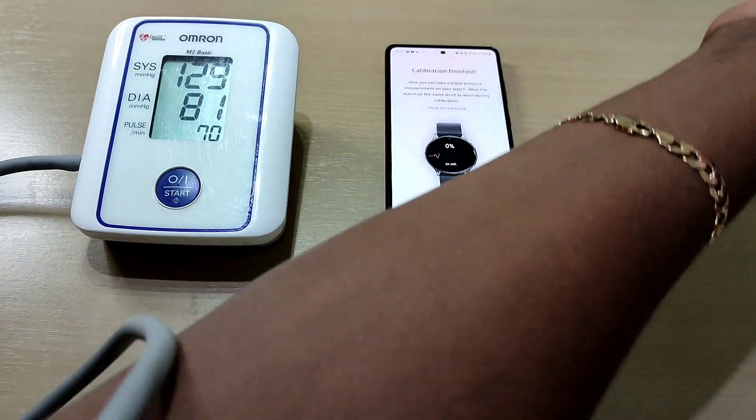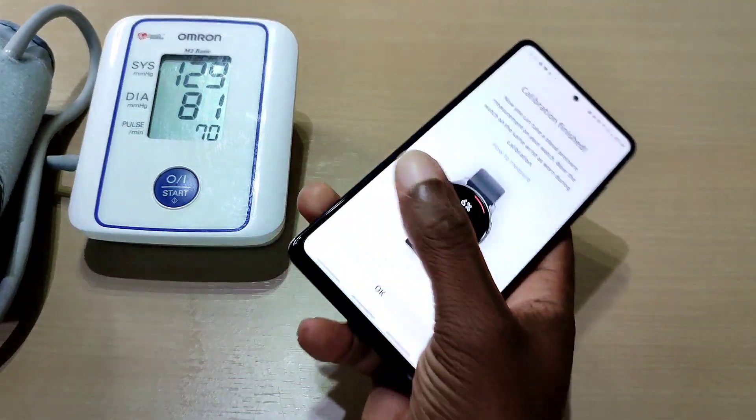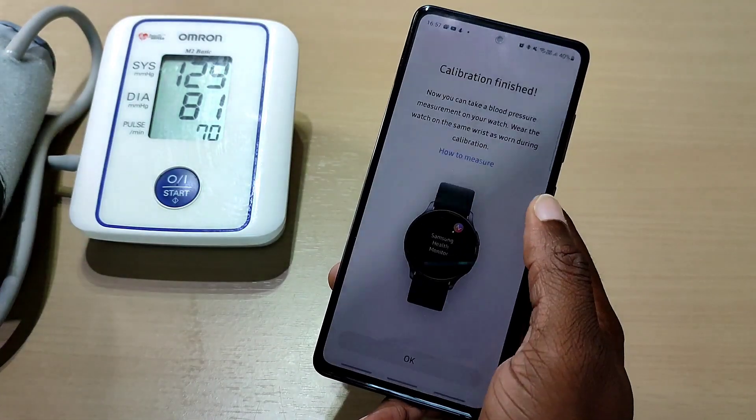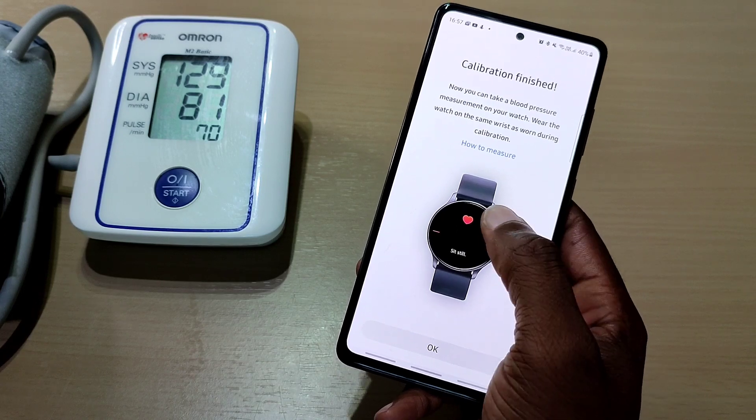Calibration is finished. Now you can take a blood pressure measurement on your watch. Make sure the watch is on the same wrist as it was during calibration.